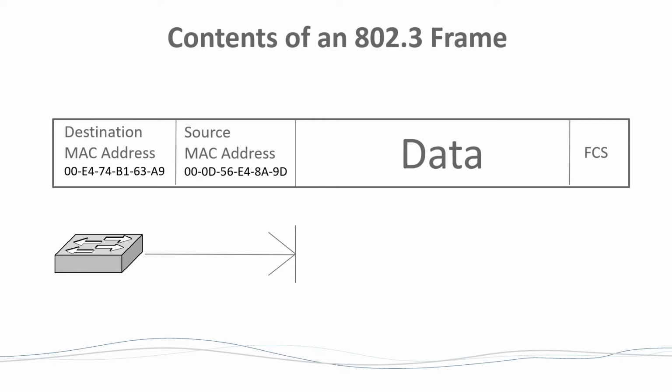I'm not smart enough to know exactly how that works, I'll be honest with you, because it seems like to exactly represent 32 bits of data, and to keep it unique, I would need a 32-bit number. But mathematicians will say, no, you don't need that. It should be much shorter. So I don't know how they do it. It's magic to me. But that checksum says, this is what the data looked like when it left here. Okay?